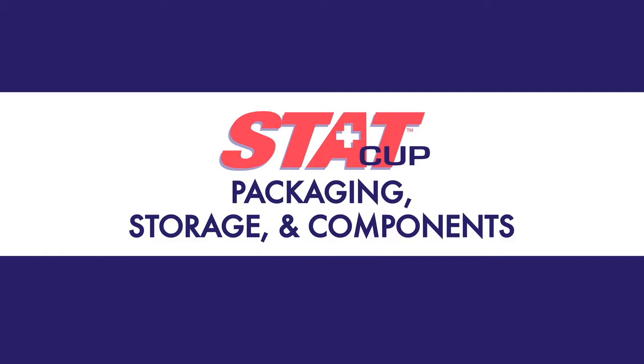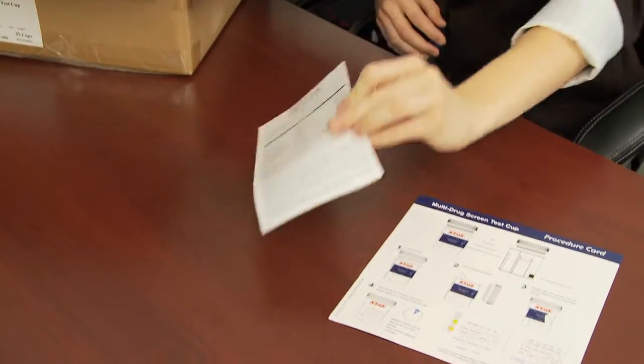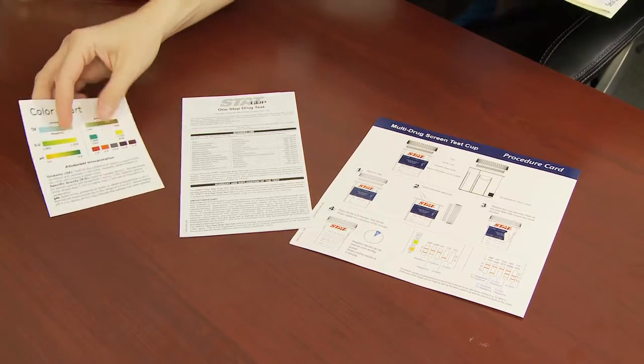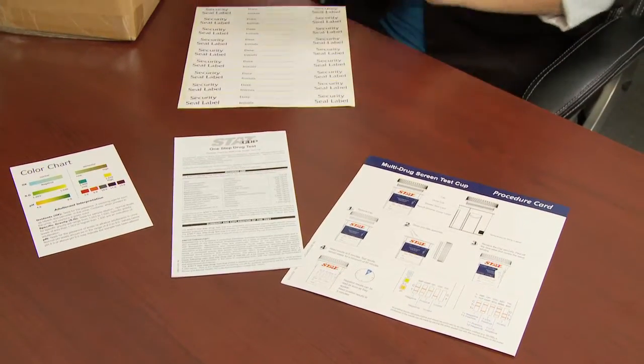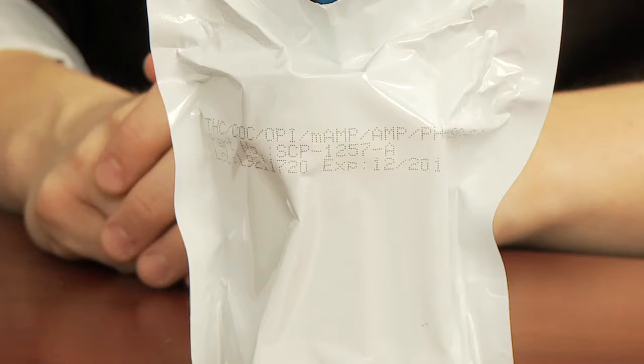StatCup packaging, storage, and components. StatCup tests are packaged in boxes of 25. Each box also includes an instruction card, package insert, adulteration color chart, and security seals. Each StatCup is packaged in a sterile, sealed foil pouch and labeled with a product part number, the drugs and alcohol to be tested for, an expiration date, and a production lot number.